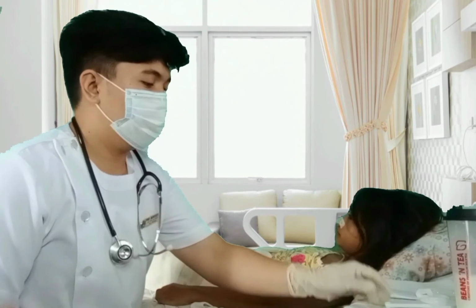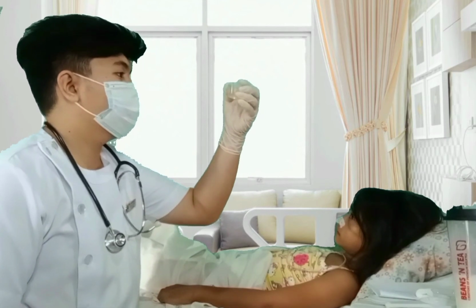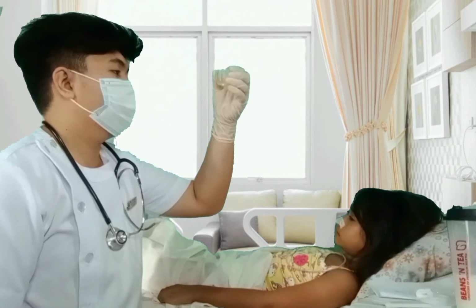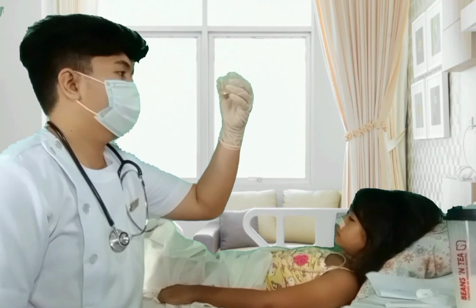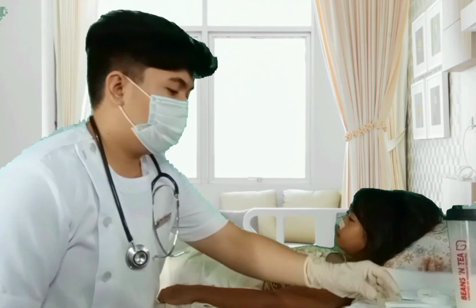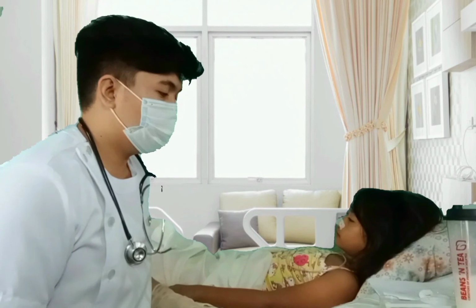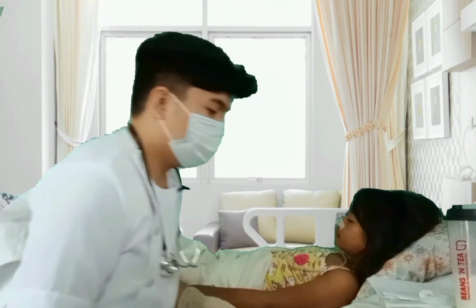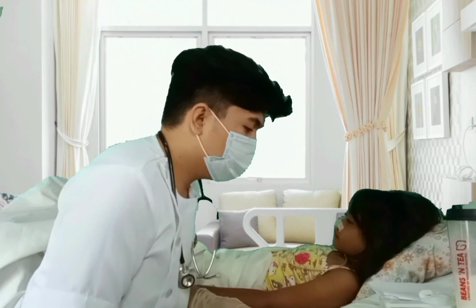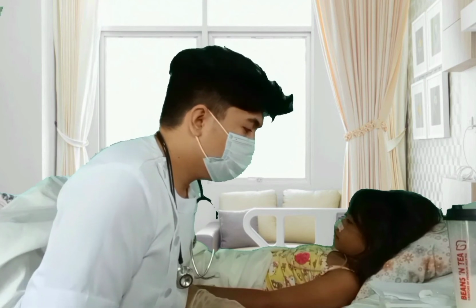Observe the aspirate's appearance. Gastric fluid is usually cloudy and grassy green or tan or off-white in color. In contrast, intestinal fluid is usually deep golden yellow and is clearer than gastric contents. Consider the results from pH testing and the aspirate's appearance together. An aspirate with a low pH and a typical gastric fluid color indicates a high probability of gastric placement. In contrast, a golden colored aspirate with a high pH indicates a high probability of intestinal placement.